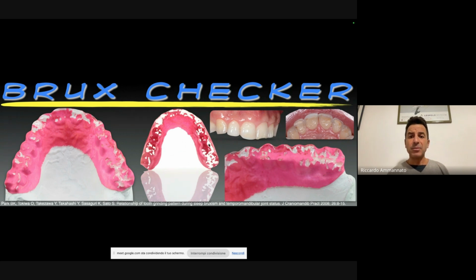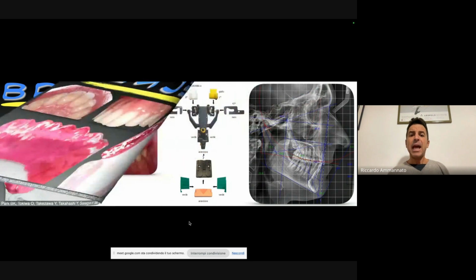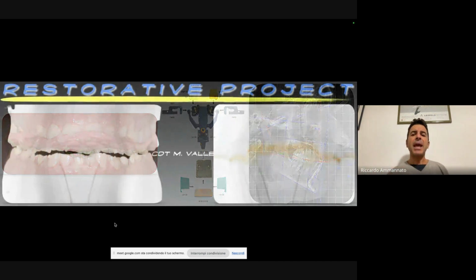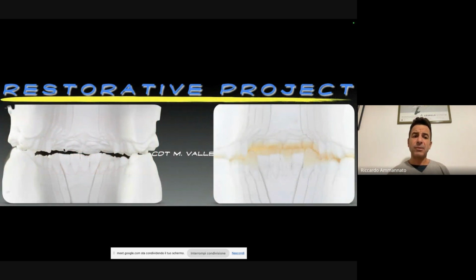And you see how he has posterior interferences. You can see here his anterior interferences. In fact, here on 21 he has a chipping. And here we are managing, I'm skipping due to time, all the provisional part with the mock-ups, as I mentioned in the beginning, and this is the vertical dimension of occlusion that we decided to increase. I use the reference articulator, so we went through an analog workflow, and we also did condylography and all that, and this is the space that we wanted to augment.